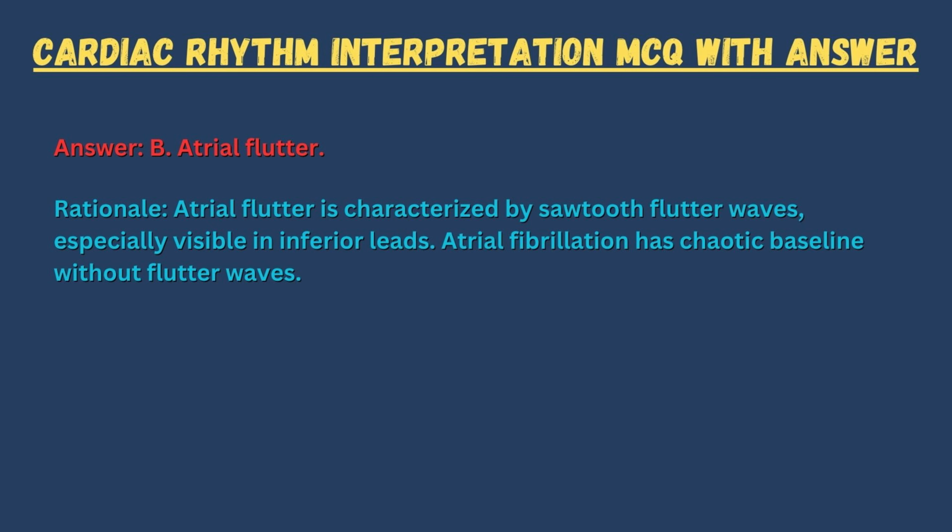Answer: B. Atrial flutter. Rationale: atrial flutter is characterized by sawtooth flutter waves, especially visible in inferior leads. Atrial fibrillation has chaotic baseline without flutter waves.